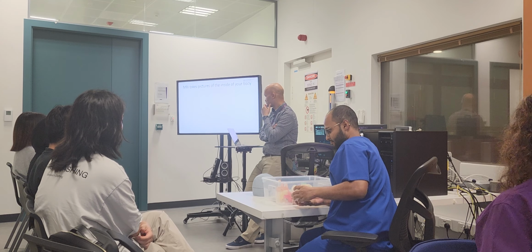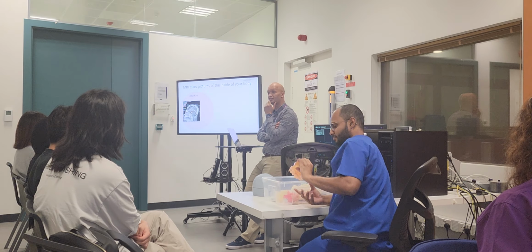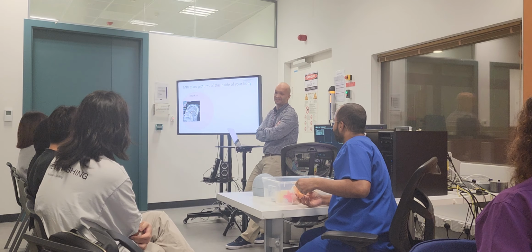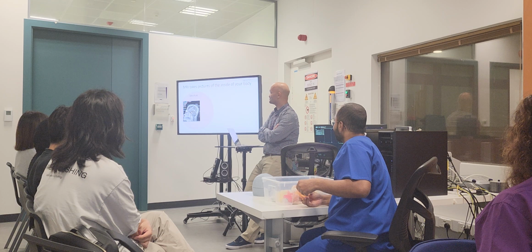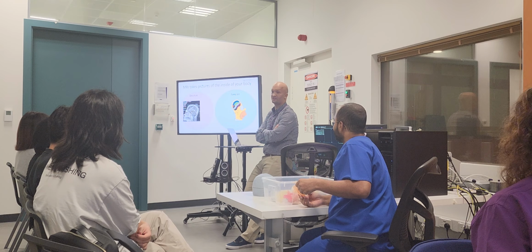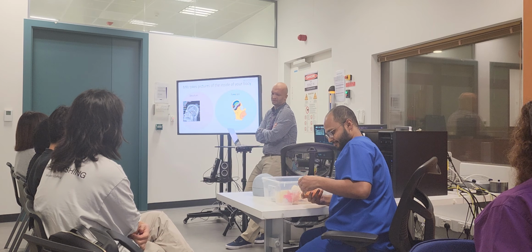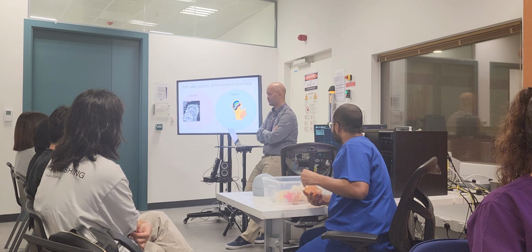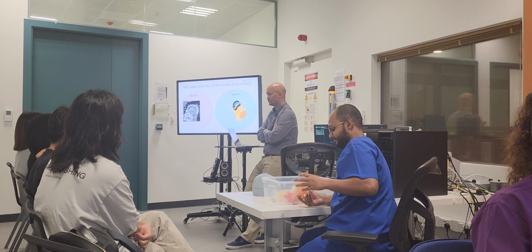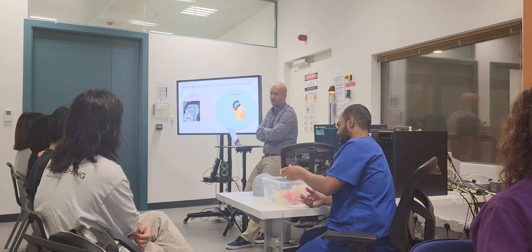The only difference is that it takes pictures of the inside of your body, to look at the structure and look for foreign objects. It's also used to assess function: what you like, what you don't like, whether you can move your arms, which areas are specialized for what function. We have visual cortex, motor cortex, sensory cortex, language cortices, and you name it.